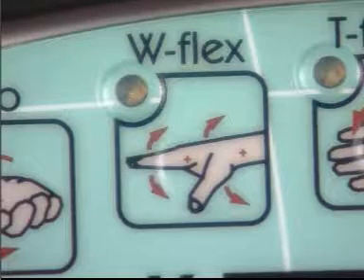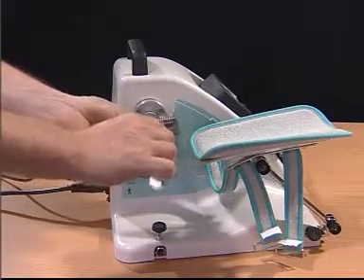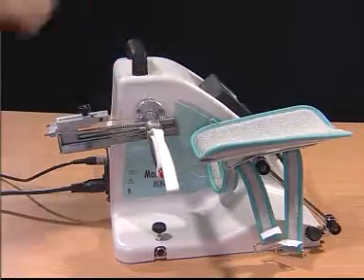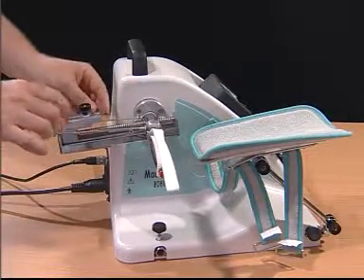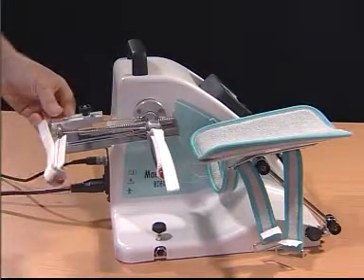The next movement is wrist flexion extension with MCP flexion, also known as tenodesis. Place the wrist support and adjust the attachment of the trainer; therefore the palmar support will be placed further distally.